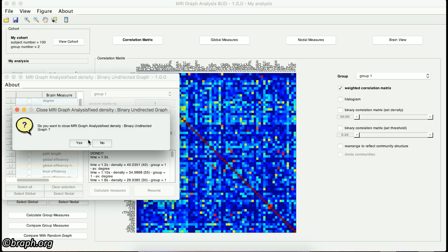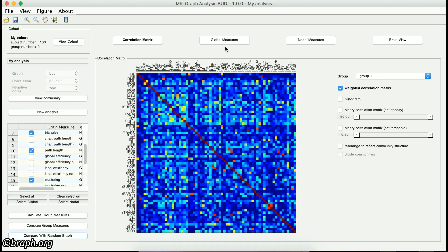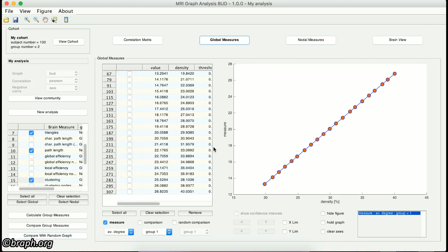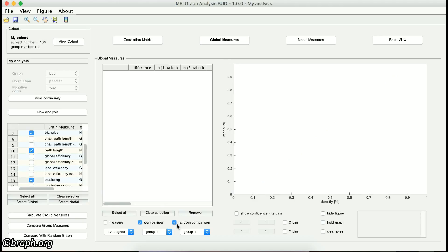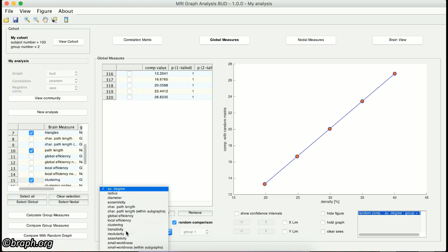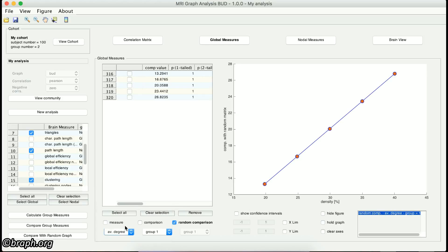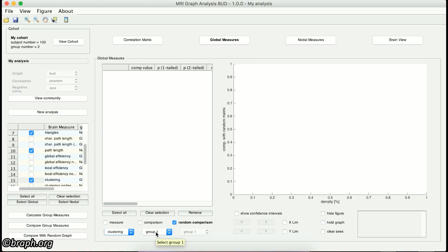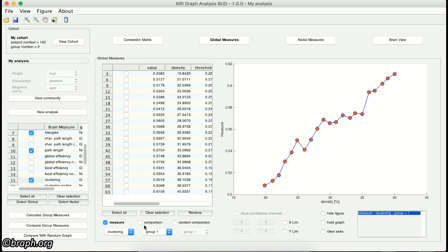You can see the results of the analysis in either the Global Measures and the Nodal Measures panels or the BrainView panel. First, I go to the Global Measures panel. On the left side of this panel, you can select the results you want to see. By clicking on each of these checkboxes, you can see the group measures, between-group comparisons, and comparisons with random graphs. From this drop-down list, you can select the measure you want to see, and from these drop-down lists, you can select the groups. After you have selected the measure or comparison, you can see the results in this table.